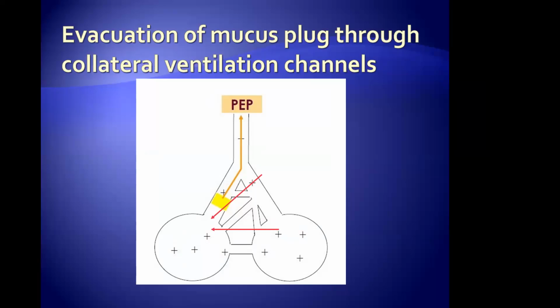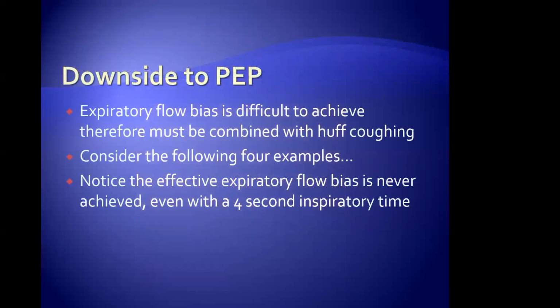So how does that work? Now I'm going to get that mucus out because now the pressure is equal on both sides, and I'm going to push that mucus plug out. So now I've achieved my goal, and we do this all the time. We see it, we do it all the time.